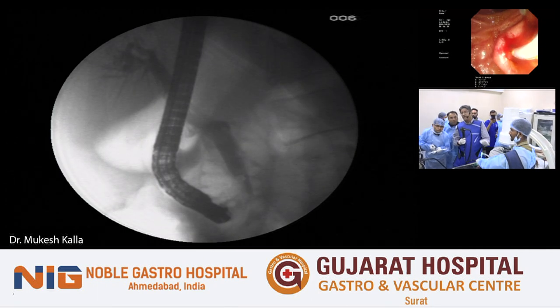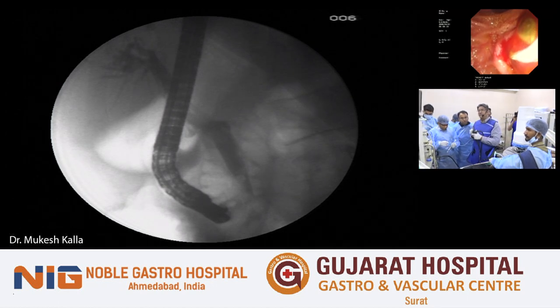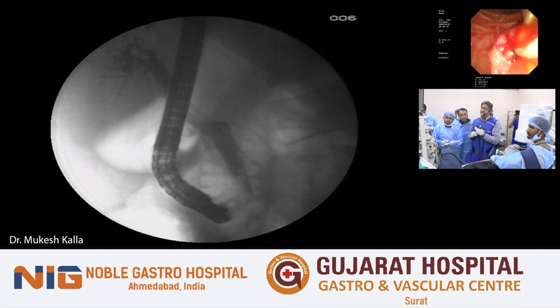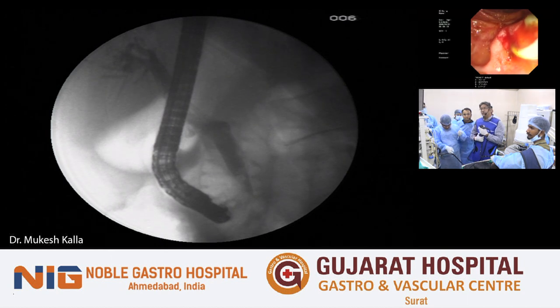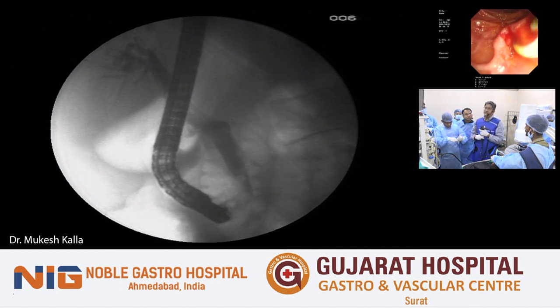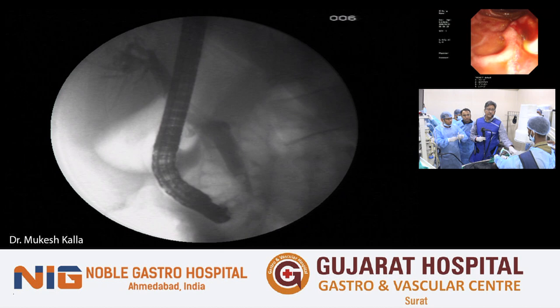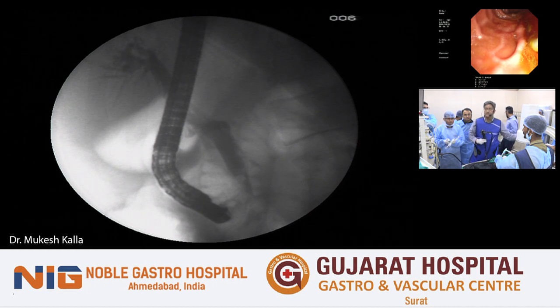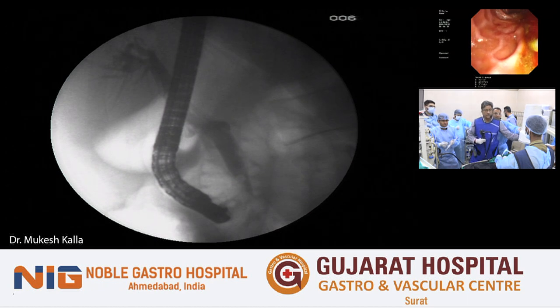Nilay, I would like your comments on this, because the proper opacification of the cystic duct in these situations is very important. There are people who do cases in supine. Some people will be happy doing it in prone. Like I do it in left lateral position. And as and when there is an overlap of the cystic duct over the common bile duct, I request my assistant to take the patient into semi-prone or semi-supine position to see. Dikhao. Another thing you can do is move your IITV also. Yeah. So I do it in prone.